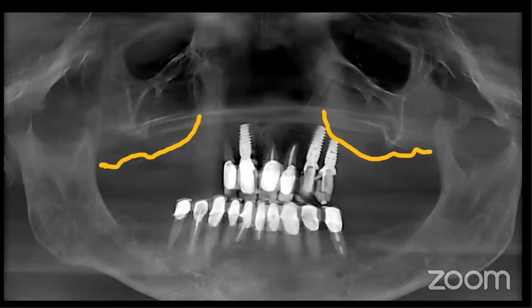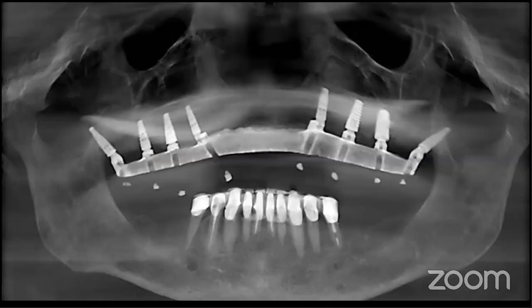So we know he has big pneumatized sinuses. And so for this particular patient, what we did was two sinus grafts. And we couldn't place anything in the anterior because the bone was just too thin. Now, this patient didn't want any zygomatic implants.